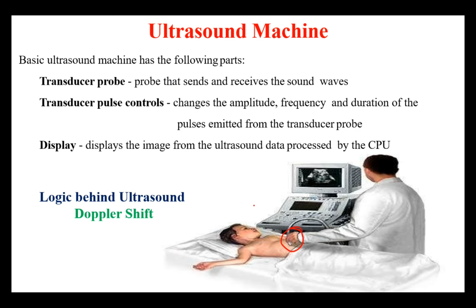Yes, exactly. Metals, in the sense that in any medical imaging metals are strictly not permitted, but ultrasound is not like that. They'll allow metals, but for CT and MRI you will definitely not be allowed to enter. Before going for an ultrasound, you need to drink a lot of water, right?